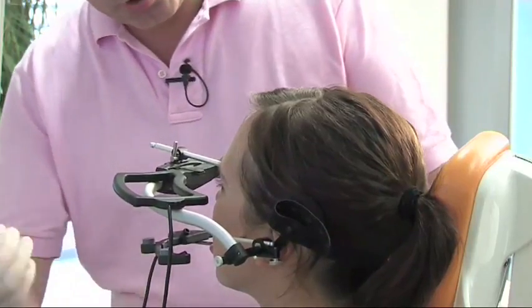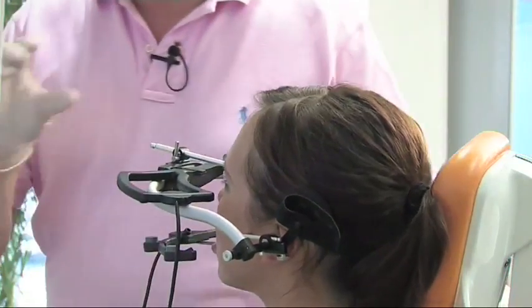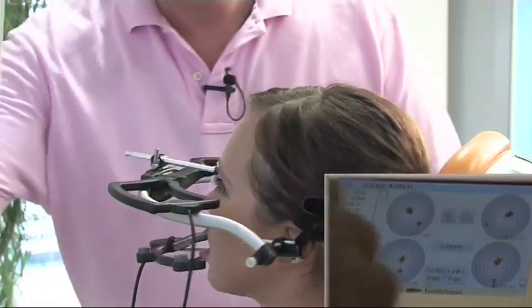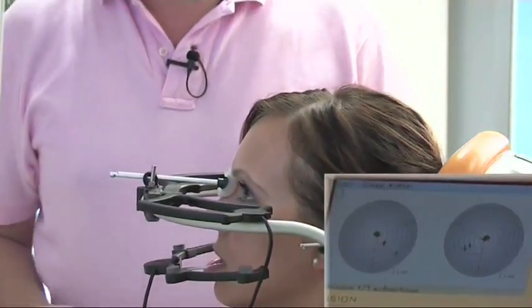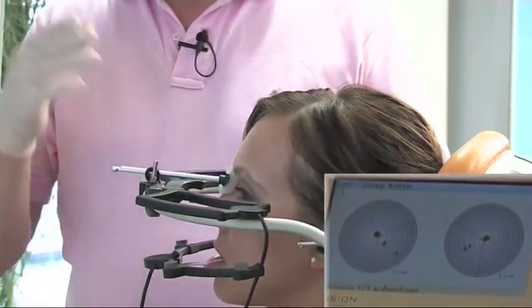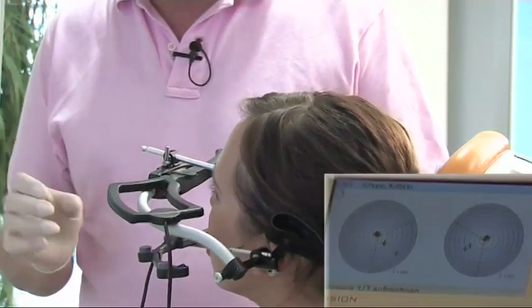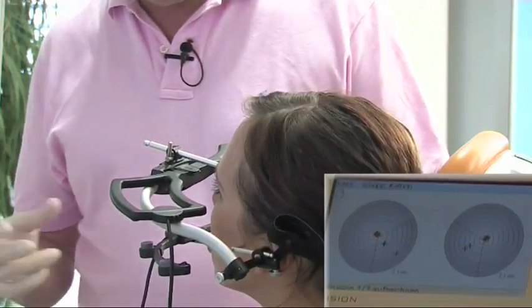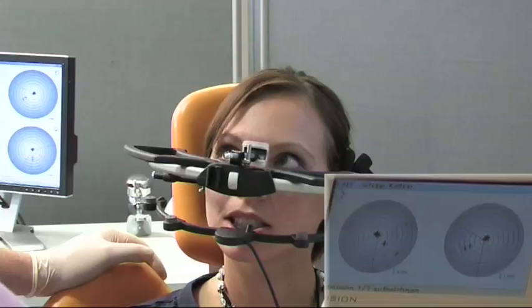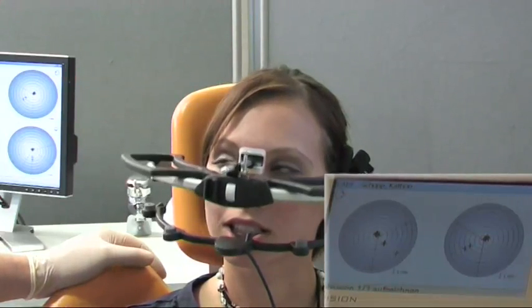The analysis has shown this, and now we have to transfer this information into the correct splint. So we press here to enter the splint menu in order to make a drawing for the production of a splint by means of auxiliary equipment. This is so constructed that there will be no pressure causing pain when you move your condyle. Do you understand the principle?